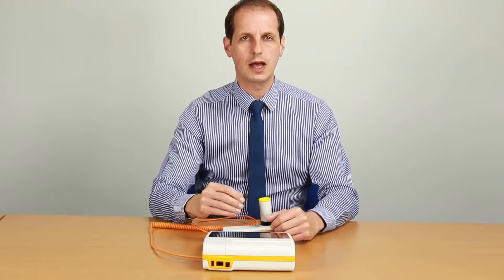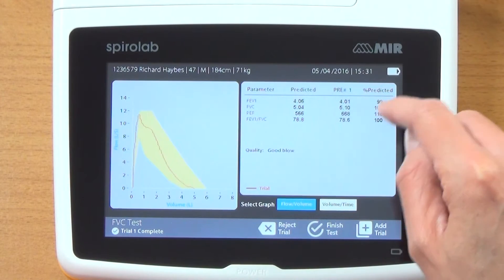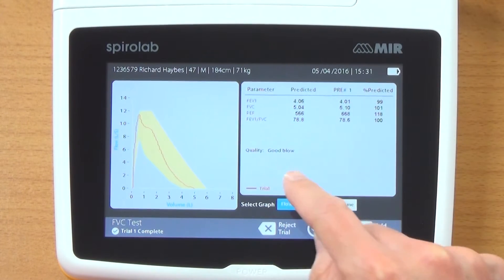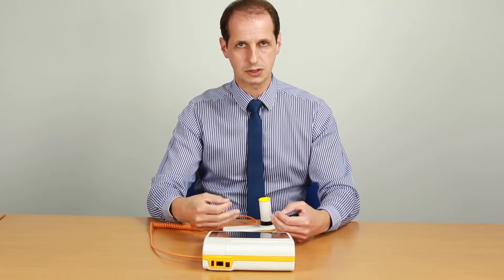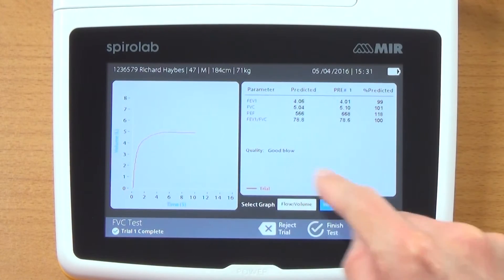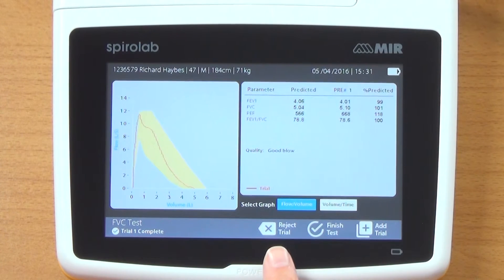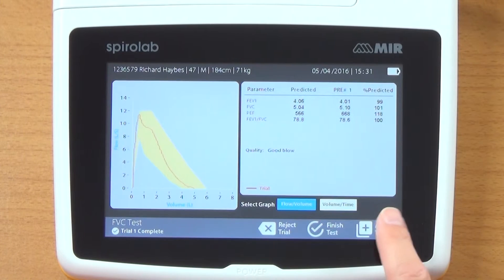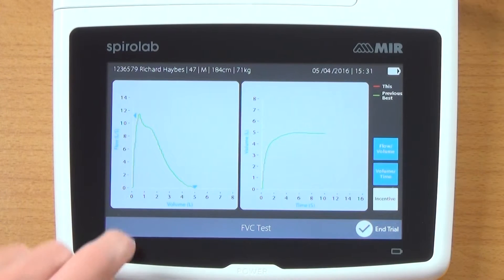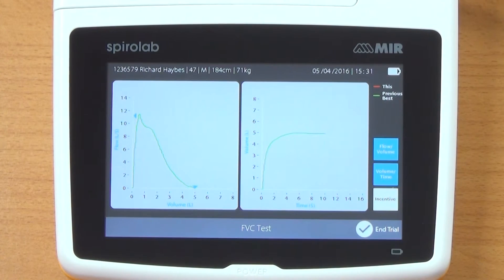Over here we get the basic parameters: FEV1, FVC, peak flow, and the ratio. We can see the predicted for each one, my current best and percentage predicted. It tells us it was a good test, and it will indicate if there was a slow start, abrupt end, or possible cough. We can also look at the volume time graph. I'm going to click add trial — the option is there to reject it or finish test. The blue arrows indicate where I previously got to for volume and peak flow.